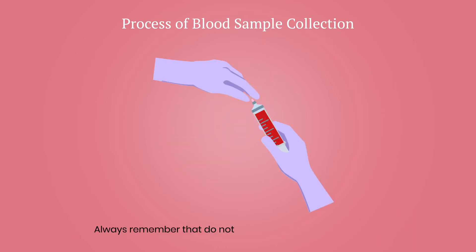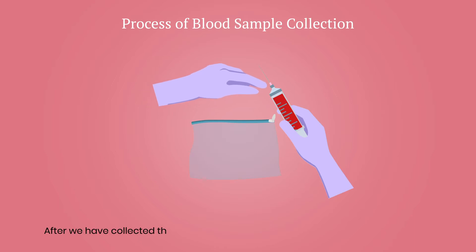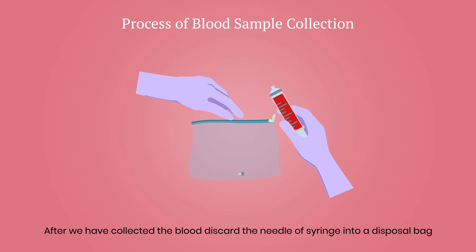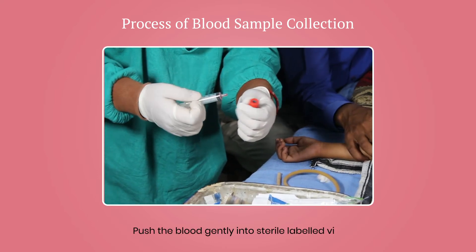Always remember: do not push blood through the needle. After collecting the blood, discard the needle of the syringe into a disposable bag. Then push the blood gently into the sterile labelled vial.